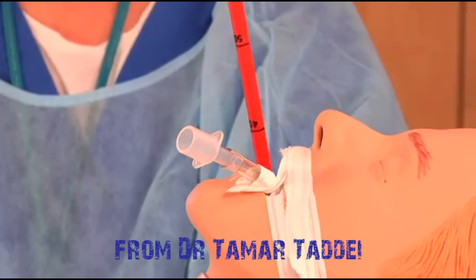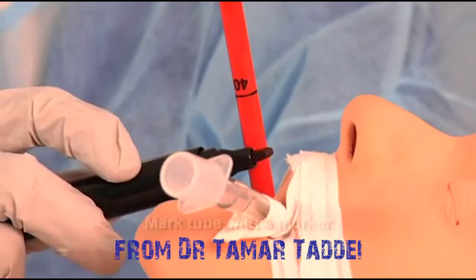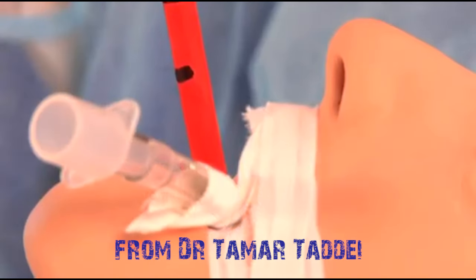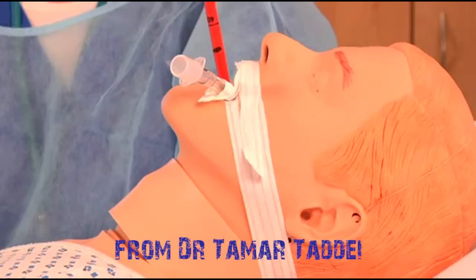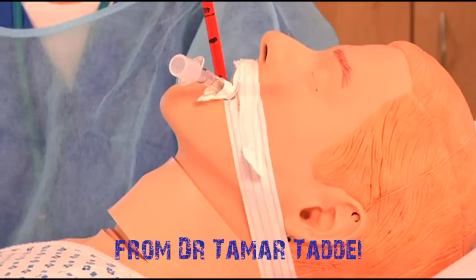Once you've got traction on and the tube is pulling up against the GE junction, mark where it exits at the level of the lips — just put a black mark there. As the tube warms up it might move out a little, but if it's moving more than about an inch, you need to be worried it's actually pulling out through the GE junction. If the patient has a hiatal hernia, get an x-ray.